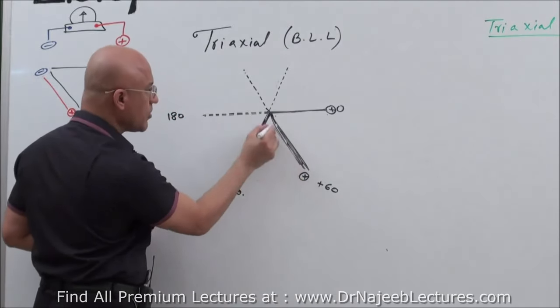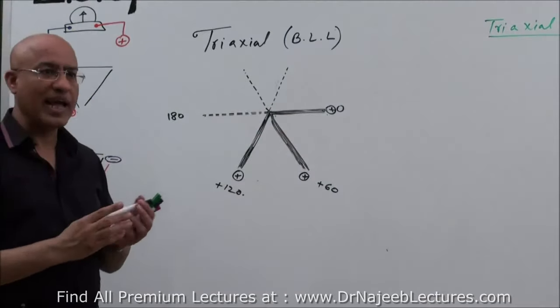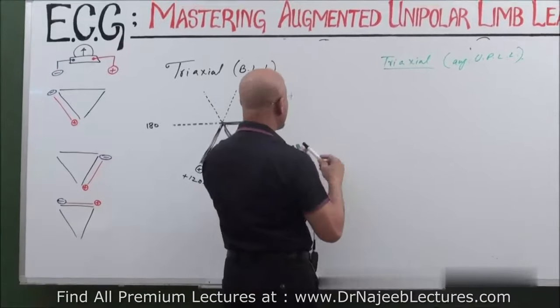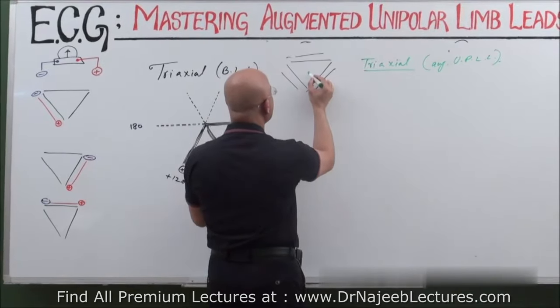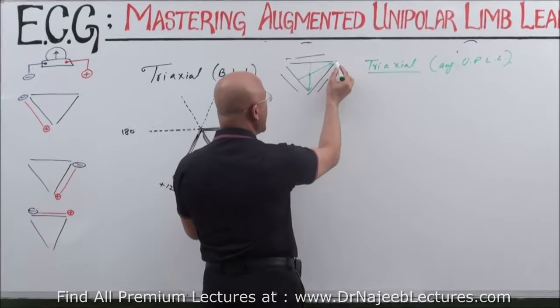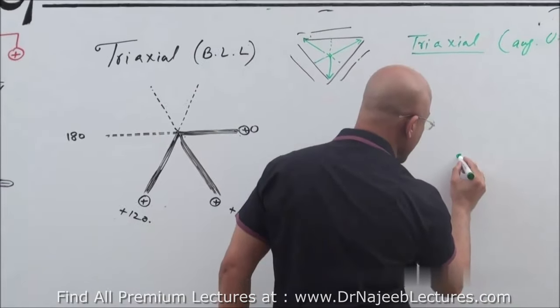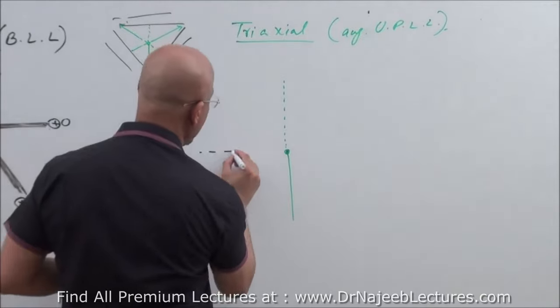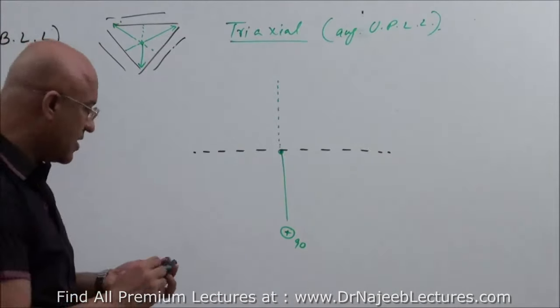Bipolar limb lead number 2, and here it is lead number 1. This is how they are angulated in reference to each other. But when we make the triaxial diagram of the unipolar leads, these were the bipolar leads, and unipolar leads were like that. AVF, here it was AVL, and here it was AVR. If you put it here, then we will see that exactly vertical is AVF. If you are still keeping lead number 1 as reference, then AVF is how many degrees? 90 degrees, right? And here is what?